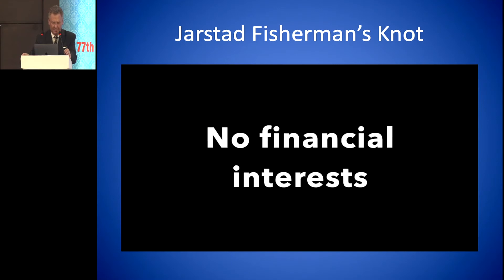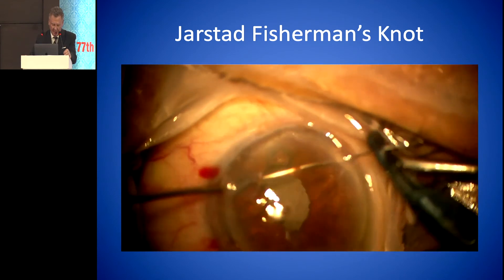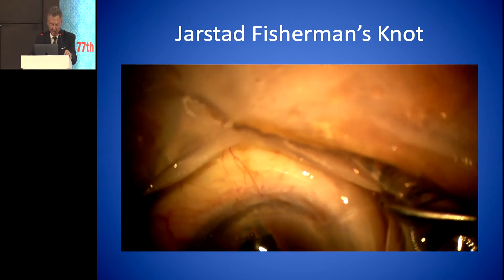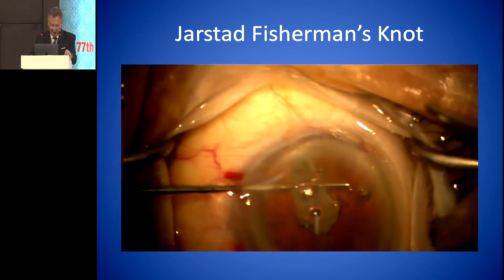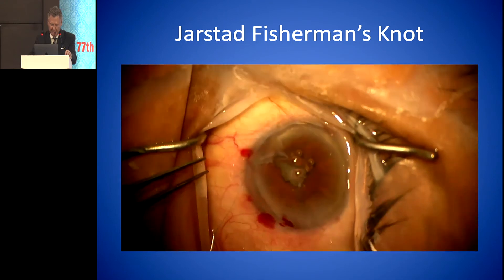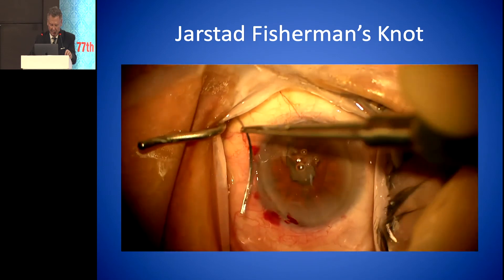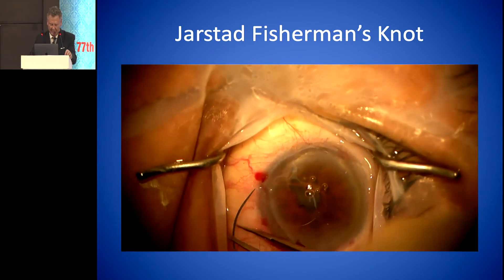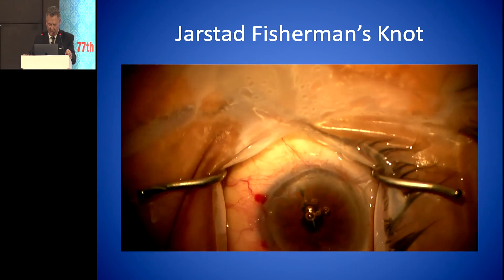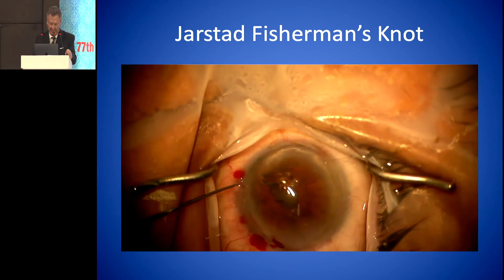This is the fisherman's knot for iris repair. We take two bites of the iris and dock the needle with a 25-gauge needle. We pull that out of the eye, then reach in and grab a loop of the suture, and twist it five times with tying forceps. Then we pass the needle through that loop — sometimes you have to pass it backwards — and gently pull it together to tie it off. That works really well. Then we put in that locking throw afterwards.